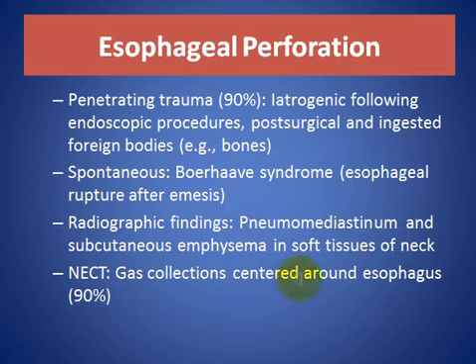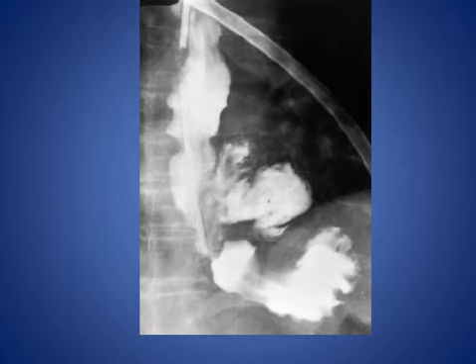On non-contrast CT, gas collection centered around the esophagus in 90%.